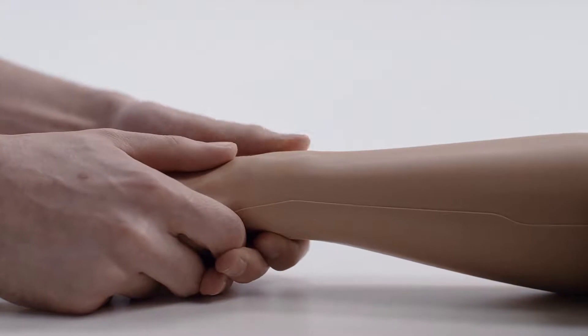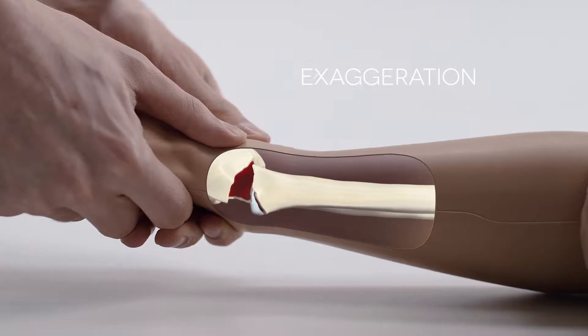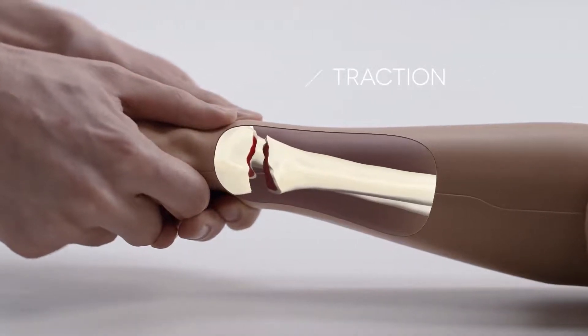Training in teams, trainees can perform all three stages of reduction: exaggeration, traction, and flexion.